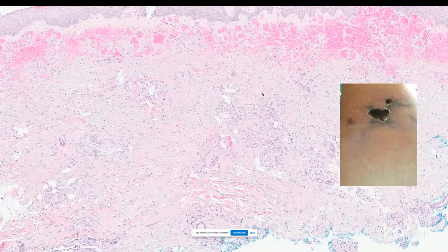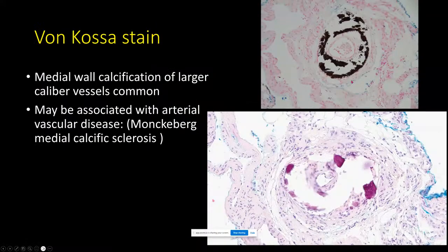And here there's increased cellularity within the dermis. I didn't have the stain to show you, but you can have diffuse dermal angiomatosis as a dermal sign of calciphylaxis. So if you stain, these are all SMA positive, and it's a immature vessel formation as a consequence to slow ischemia. You get medium vessel involvement, but this is not diagnostic of calciphylaxis.